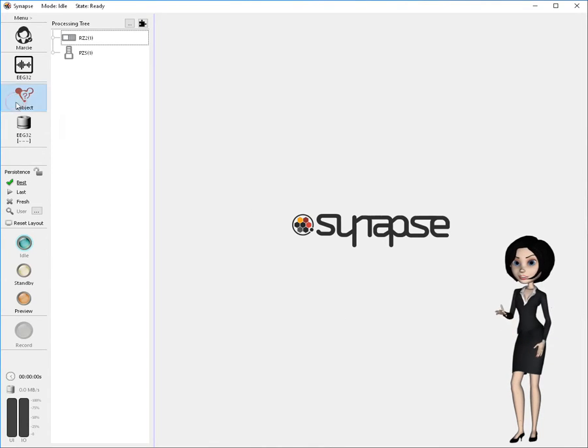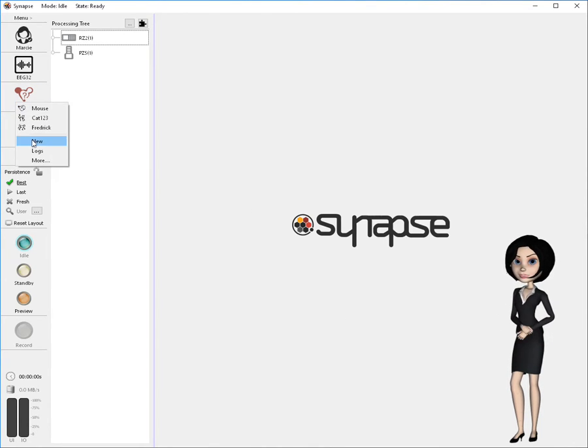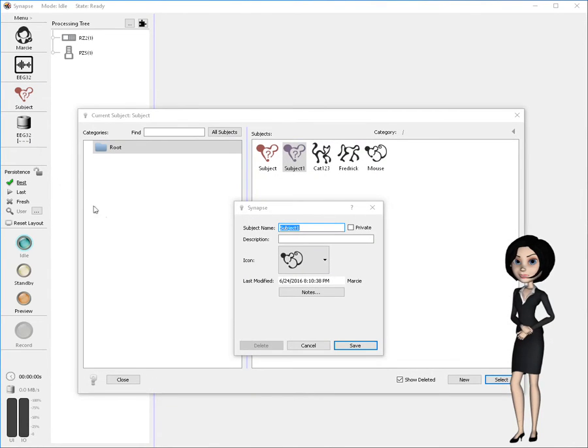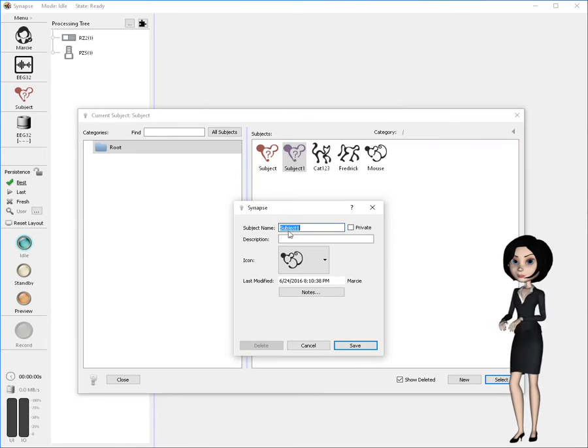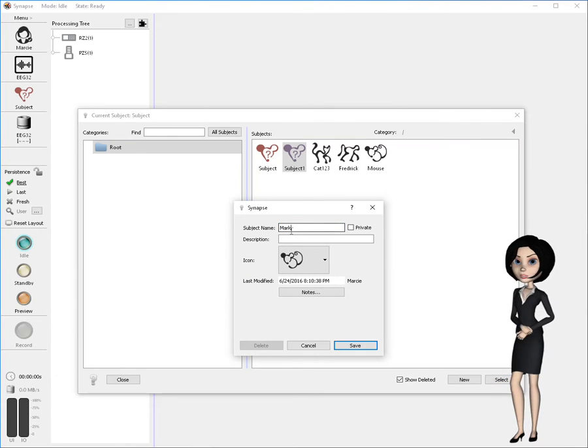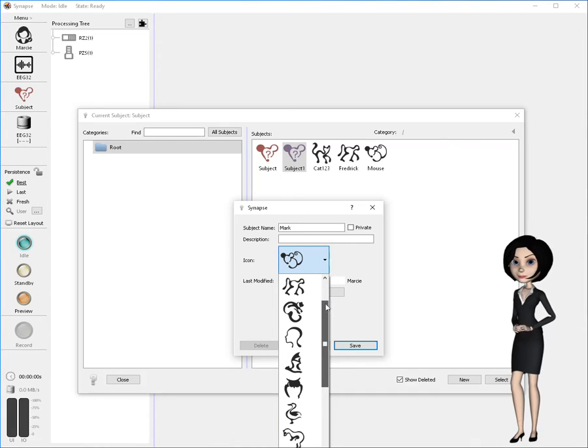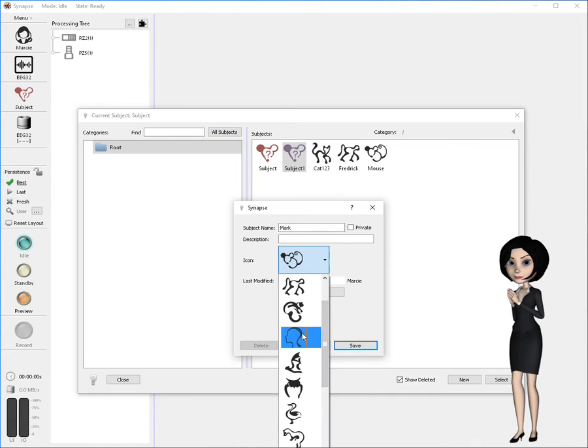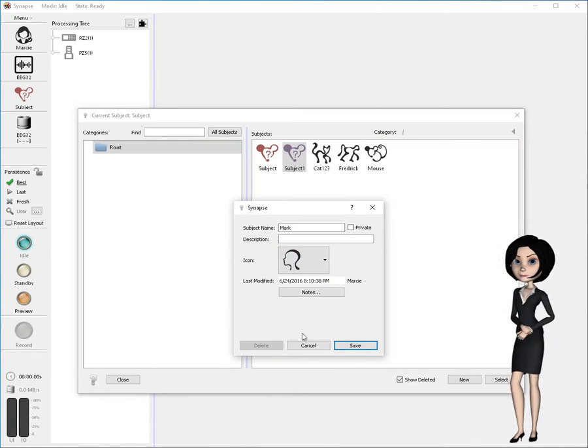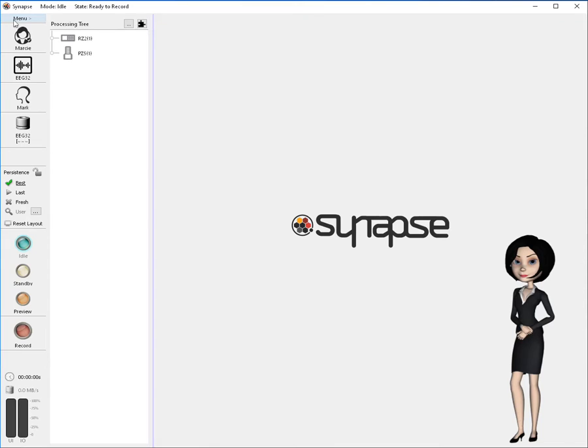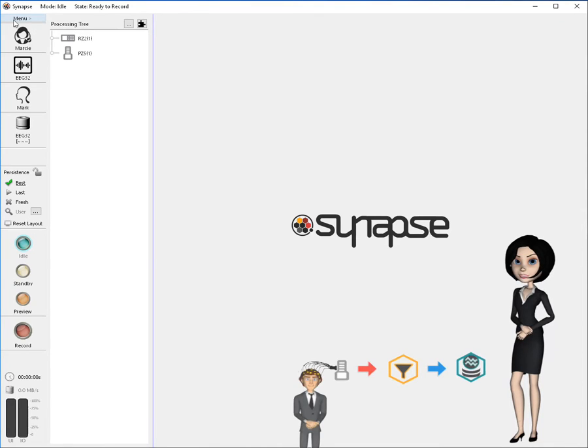Now, click on subject and select new. In the dialog, enter the subject's identifier and choose an appropriate icon. As you can see, I'm being kind in my selection of Mark's icon. Click save and your new subject has been created and made active as the current subject.